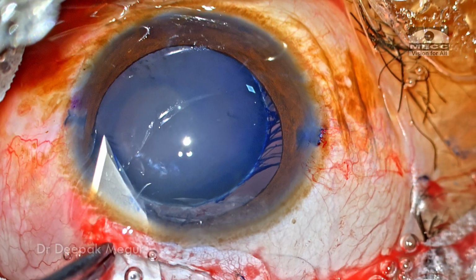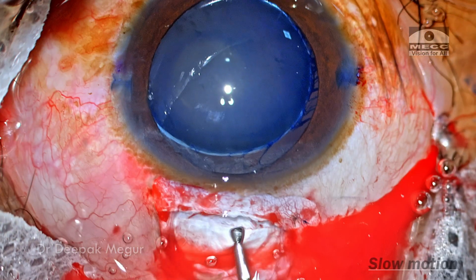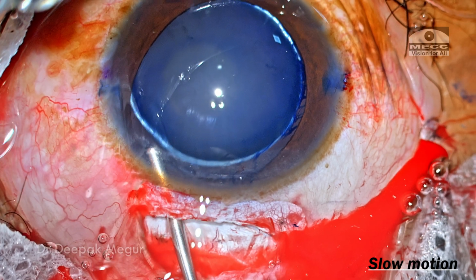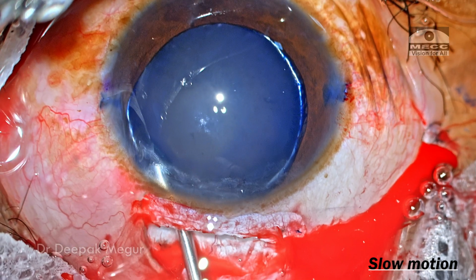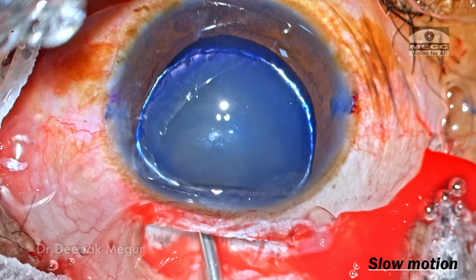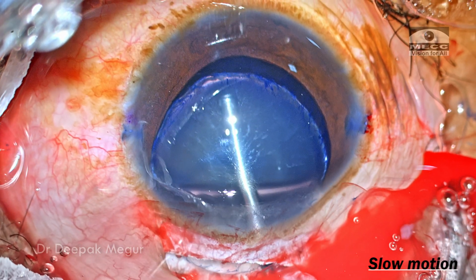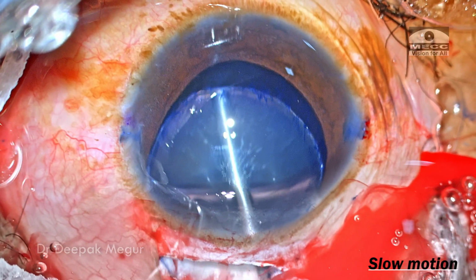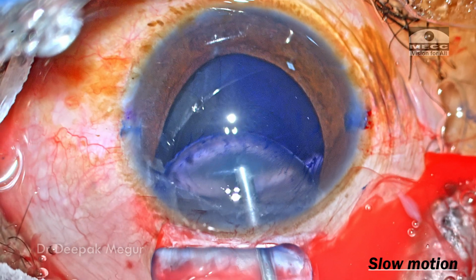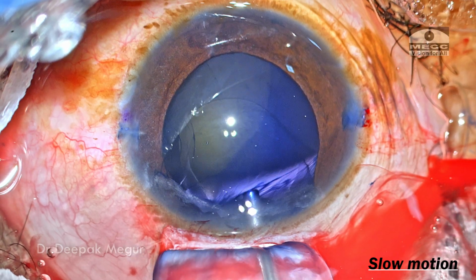So the internal incision is open. It's about 6.5 mm. Then using the visco cannula, just HPMC, I'm going to introduce it under the nucleus and then start pushing the viscoelastic. The viscoelastic is going to increase the pressure inside the eye. At the same time, I'm going to nudge on the floor of the scleral tunnel, and this ensures that the lens is pushed towards the sclerocorneal wound and eventually expressed out.